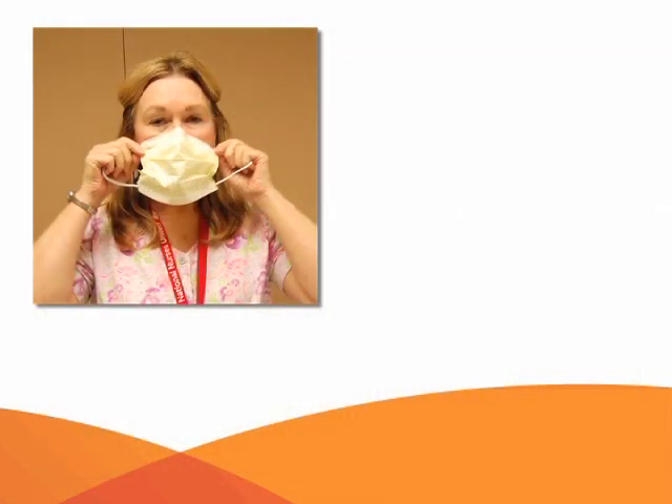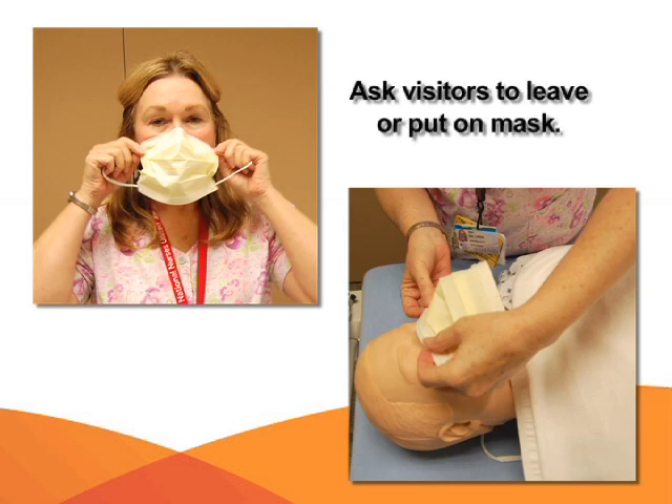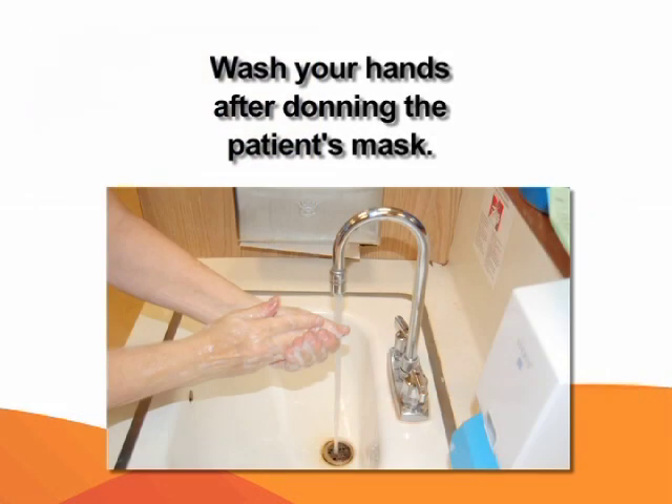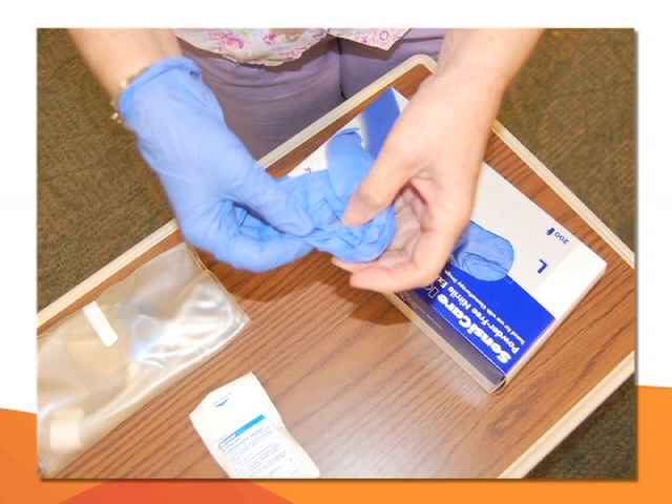Put your mask on and assist the patient with putting on their mask. Ask visitors to leave the room or to put on a mask if staying. Wash your hands after donning the patient's mask. Remember to use aseptic technique while performing the CAPD procedure. Put on your blue gloves.